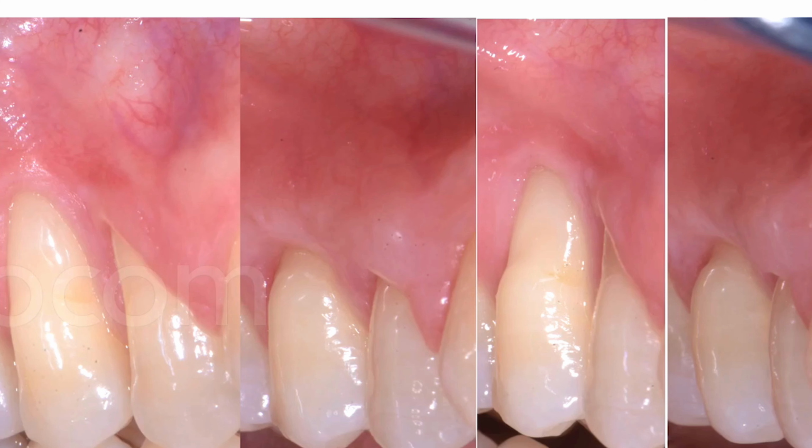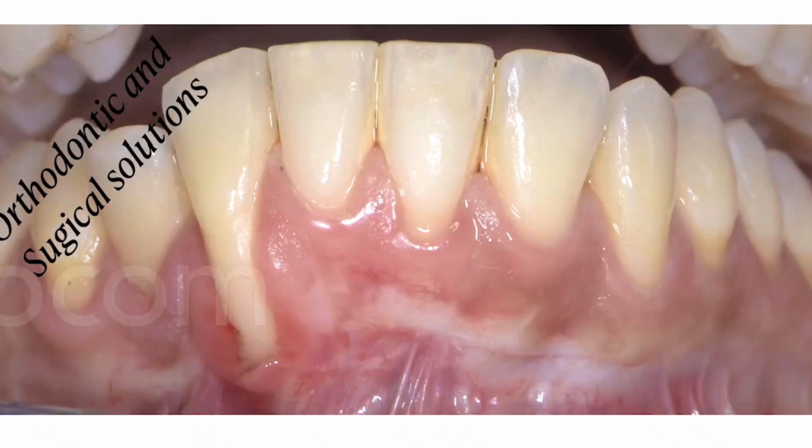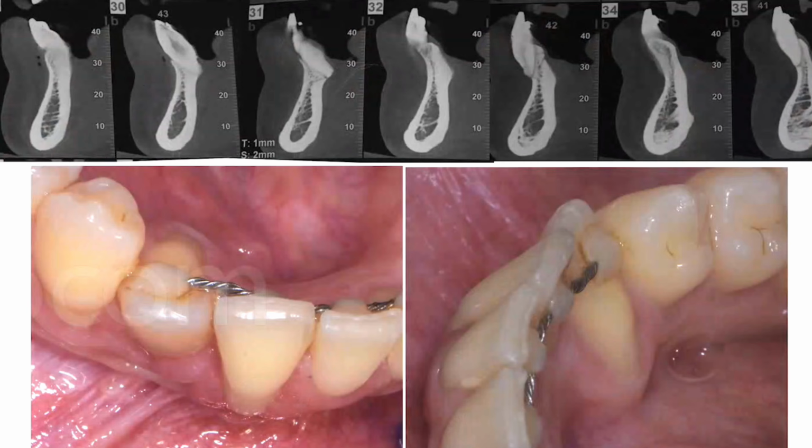So I think this is the maximum you can do for the patient, and don't try to do anything else. Okay. And would you do a different approach in suturing like you will do with implants when you attach, let's say you can't really attach anything to this papilla, would you attach it to the buccal flap? No. How you do with the implants? No alternative. In some cases, we have to find an orthodontic solution.